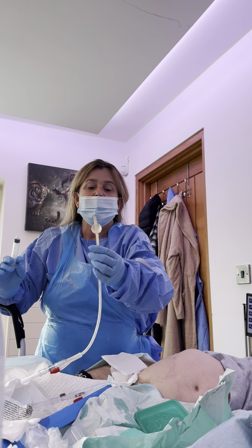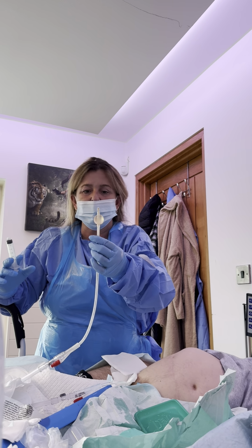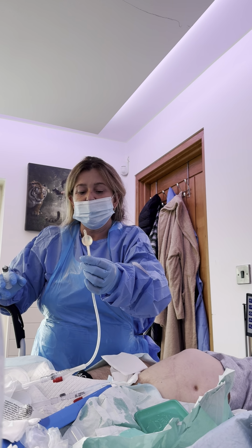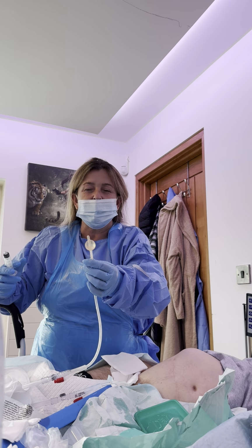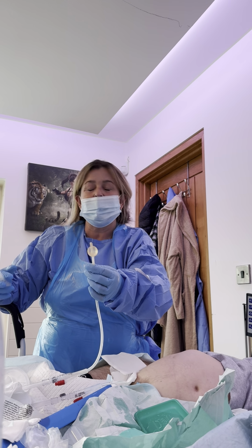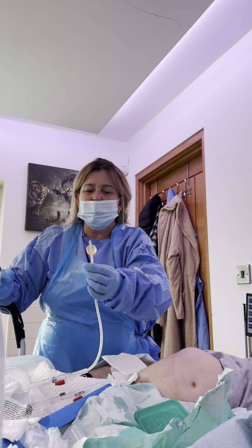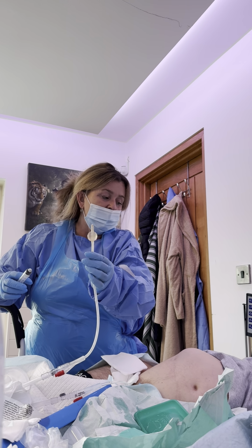all the codes, because if there's anybody else out there suffering in England with the Roosh suprapubic catheter, which really I say a two-way catheter, but it can go in a stoma, it can go up the lady, it can go in the man. You know, it's a kind of a three-way one. You put the thing blocking it. No, you haven't got a blockage actually.